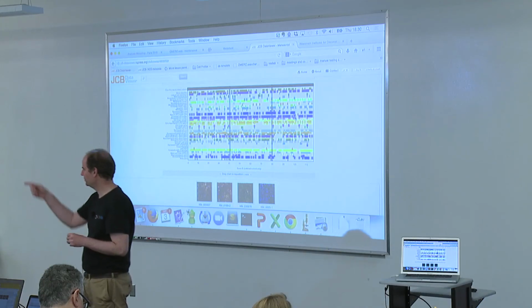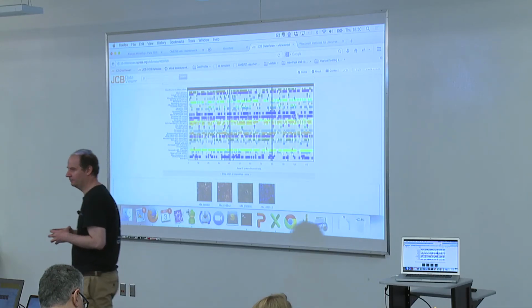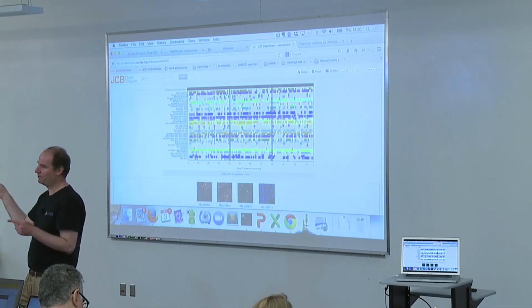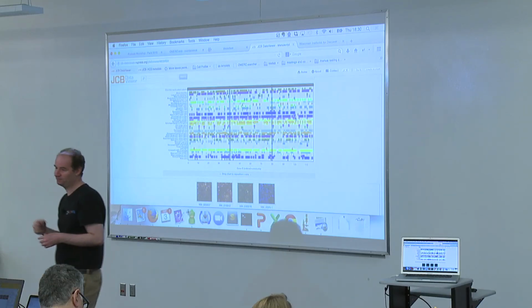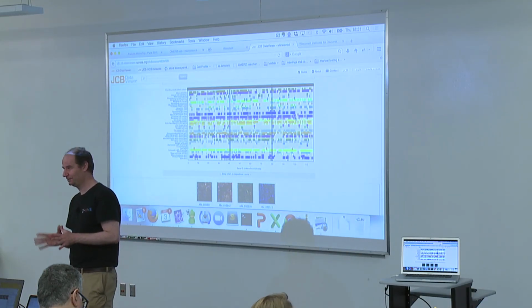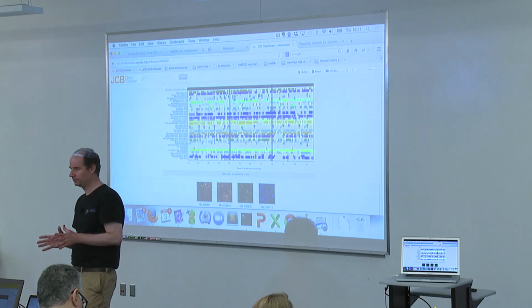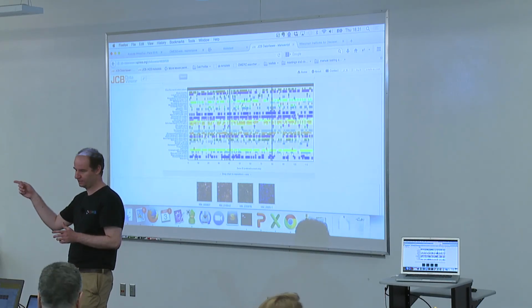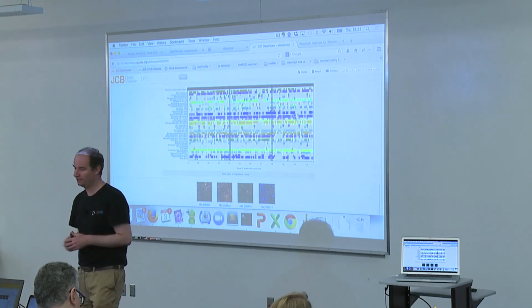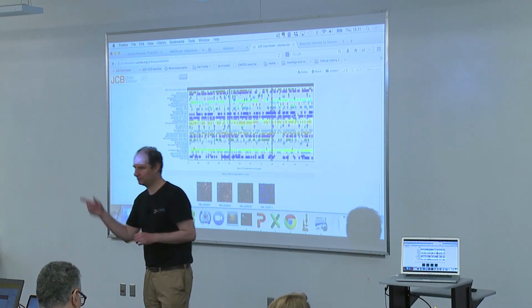The best proxy is if I can ask Melissa to answer the question. Just grab her and ask her the question. She's a much better person for the C++. The C++ exists and thrives. The name of the developer who is doing it really hard, 100%, is Roger Lee, and I can get you in contact with him. But Melissa is most aware about this part. It would be much better to talk to her.